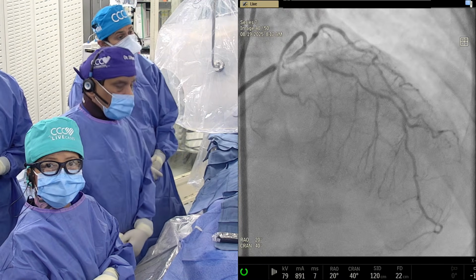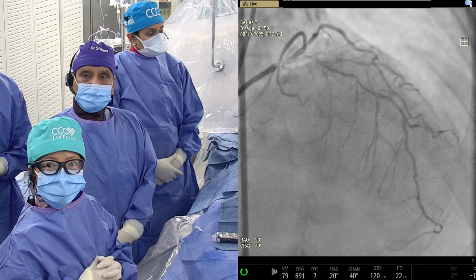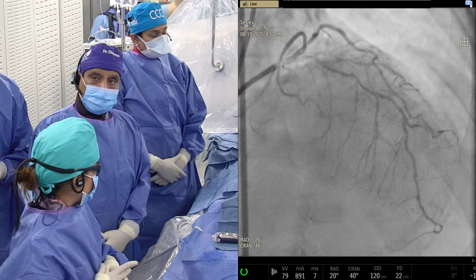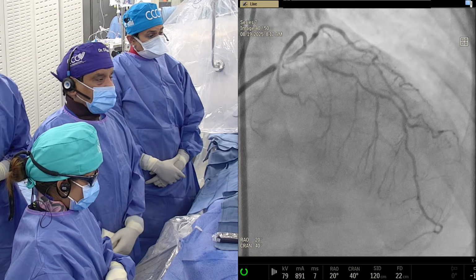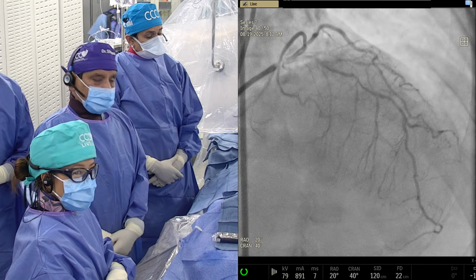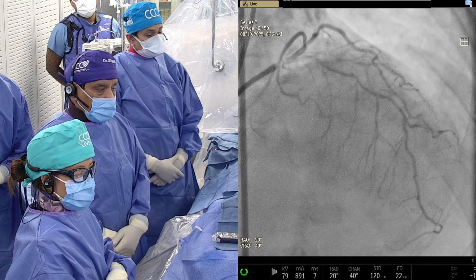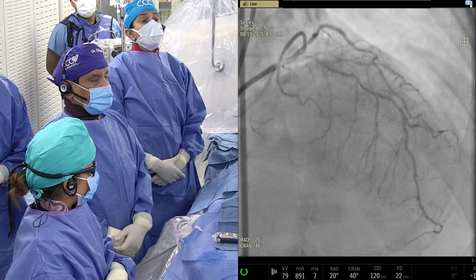Now, as you know, these are all being studied in numerous trials. We have been part of the solution, which is the sirolimus. Now we have the Magic Touch, also a drug-coated balloon, both for small vessels as well as for ISR. So all those trials are ongoing to answer. Now, large vessel, I think everybody believes your DES should be the first strategy. Large basically means a 3+ millimeter vessel.